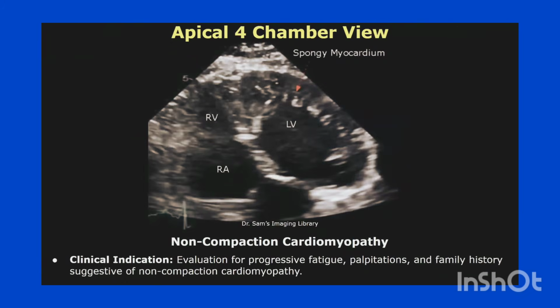This is a report of non-compaction cardiomyopathy. Clinical indications are evaluation for progressive fatigue, palpitations, and family history suggestive of non-compaction cardiomyopathy.